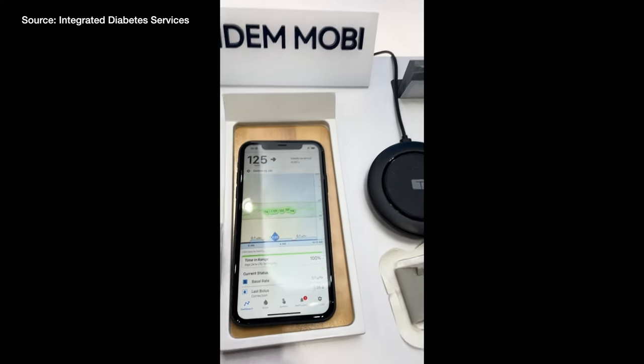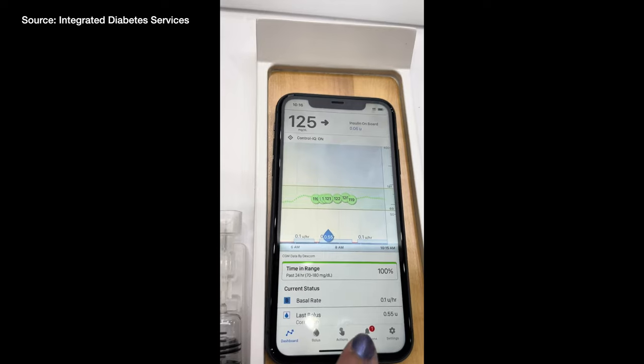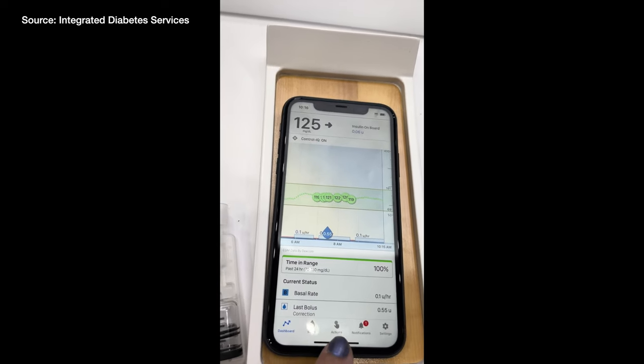The button is also a quick bolus button, meaning you can have pre-programmed settings to give yourself a bolus. This can be programmed on the phone in a couple of different ways — either through carbs or units. For example, 15, 30, or 45 grams of carbs, or one, two, or three units. The only way to change how the quick bolus is programmed is on the app, as a security feature so people can't change your pump settings.